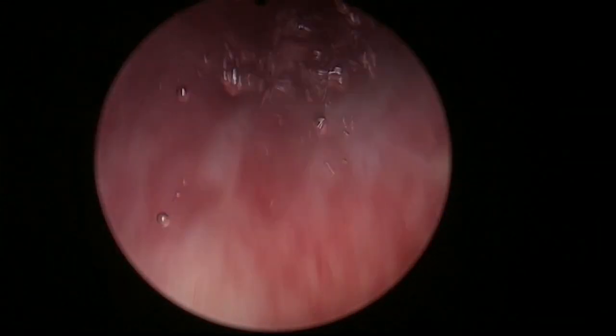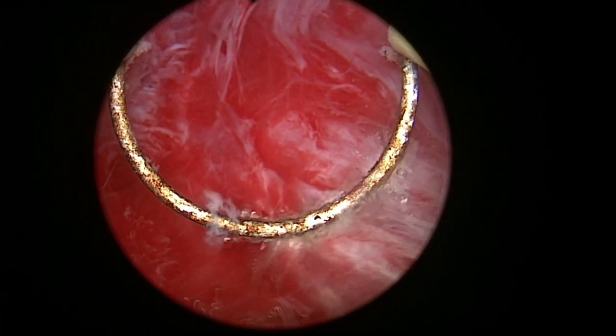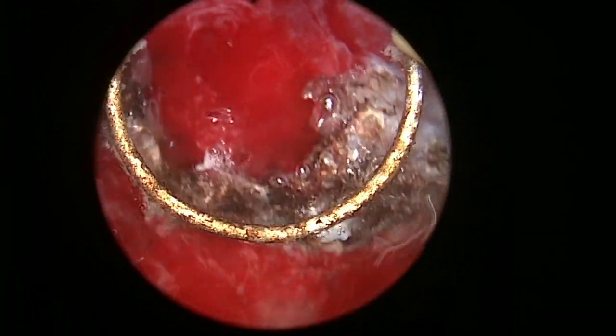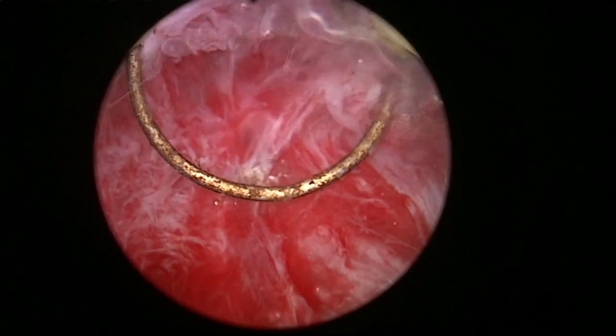And we have finished. I'm going to make a last look. Last look. Again, a good sphincter, good cavity. I don't see any major bleeding. It's more like oozing, no? And look, if you look at this capsule that looked very frightening at the end, while we were doing the laser, you can see that there's a tissue layer there, you see?